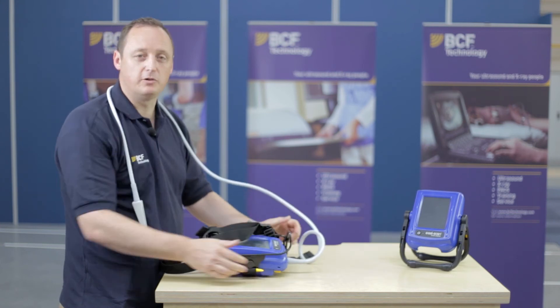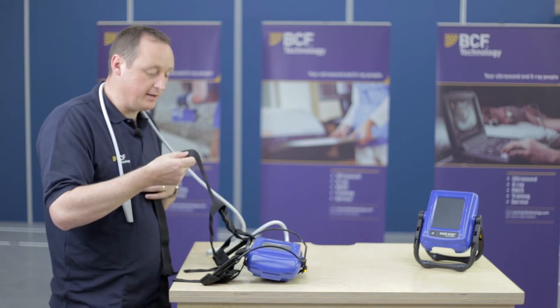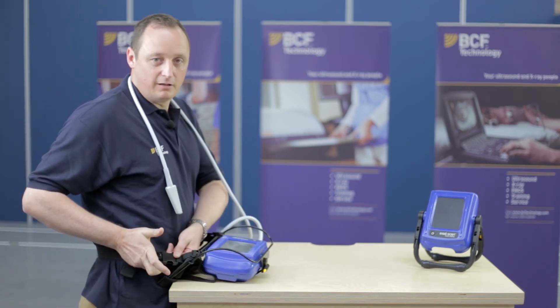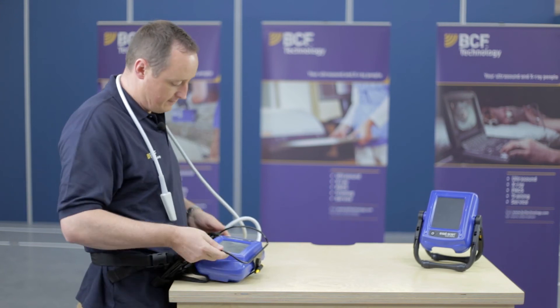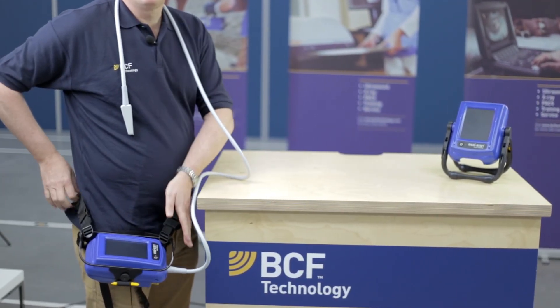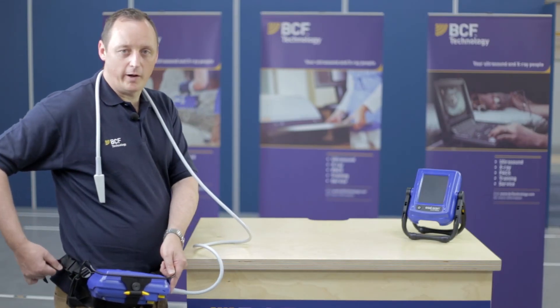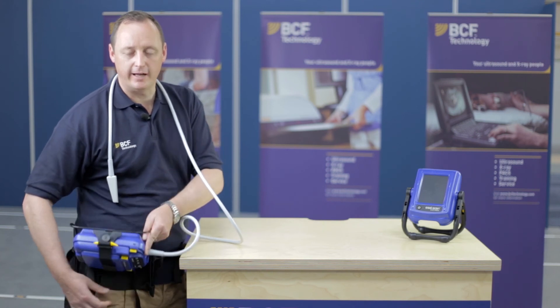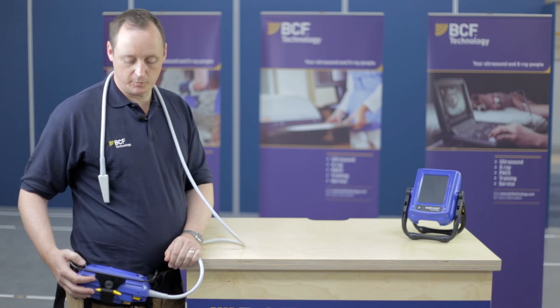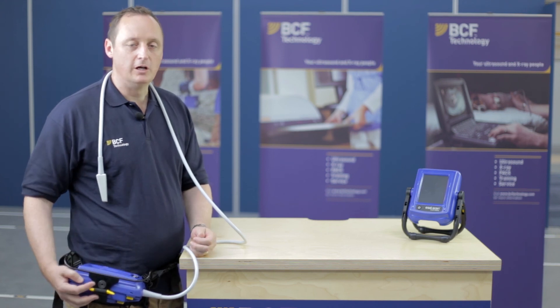We're now going to put this onto our body. We have a waist strap and a leg strap. First, orientate the straps so that it goes around your body, then connect the connector so it clicks in. Hold it down next to your leg and tension the straps to where you need it. We also have one that goes over the leg so you can get the right elevation. Now, looking at the smart display and the orientation that you'd like to see it, press the on button and you'll have the same features as on the other smart display.